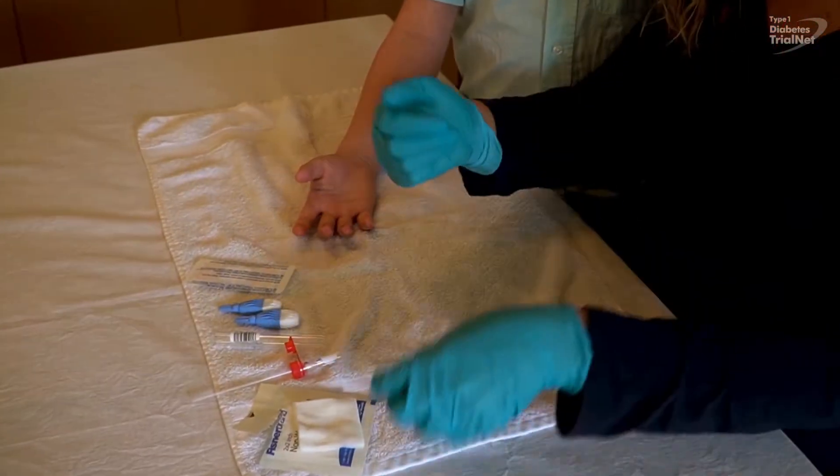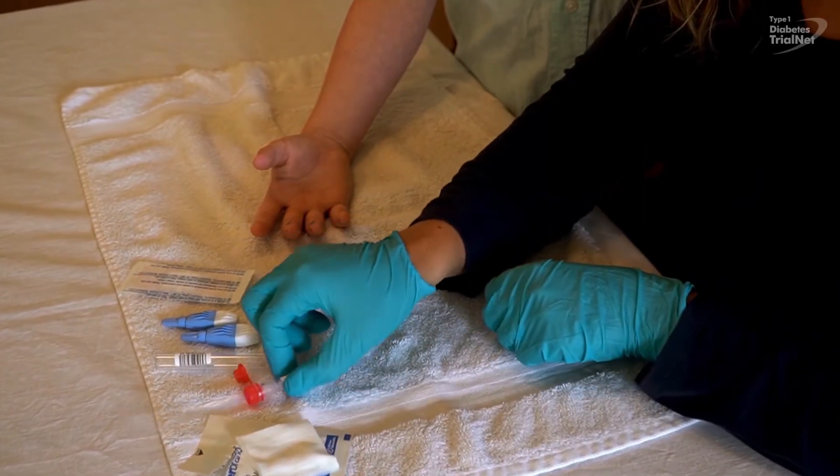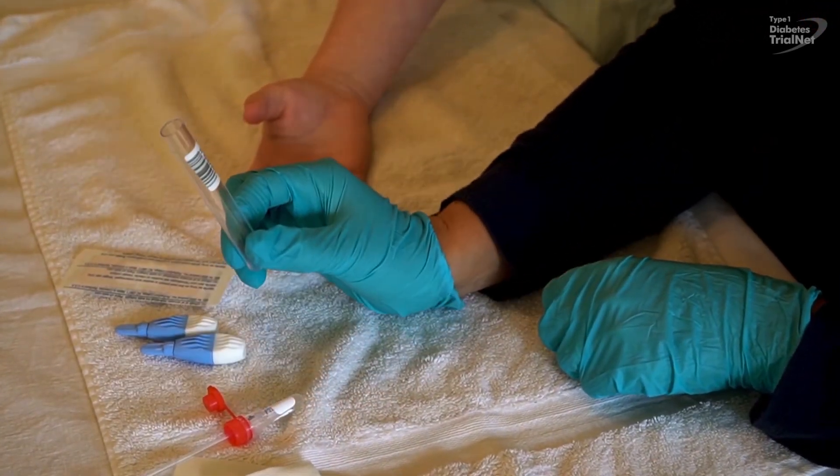Put on the gloves and have a gauze swab handy. Please also have ready the blood collection tube with the straw and the barcoded test tube holder.